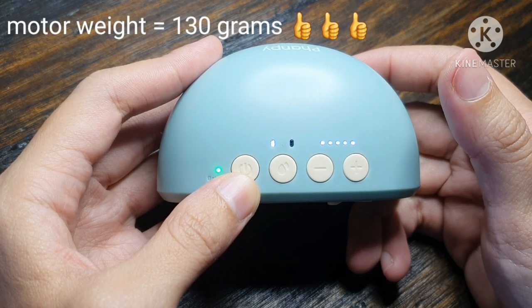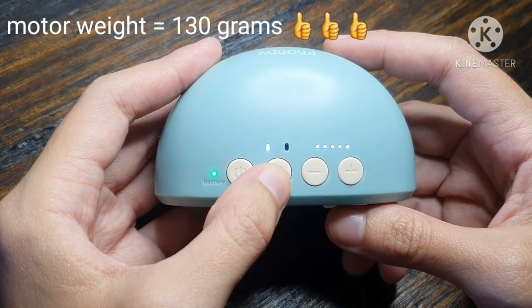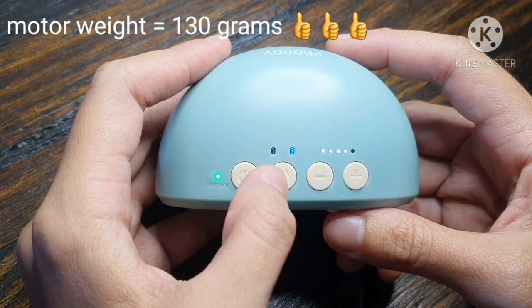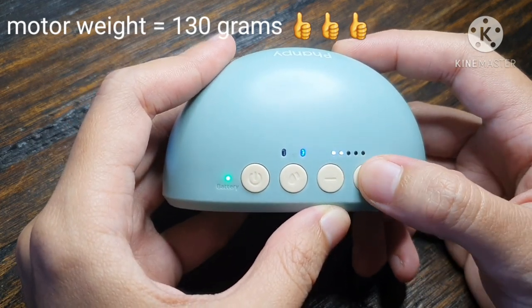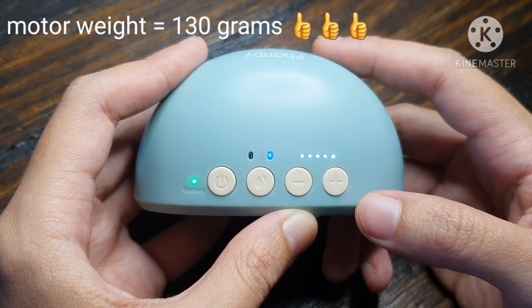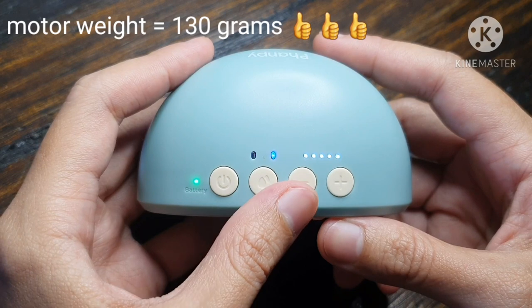Kapag naging busy kayong mga mommies, automatically from stimulation, after 20 minutes, magiging expression mode na siya. So press na natin yung button para ma-shift na siya to expression mode. Color blue siya kapag expression mode na siya. Naka-level 4 na siya. Ito yung level 1, level 2, level 3, level 4, level 5. Malakas talaga siya kapag yung suction. Hindi siya kasing quiet ng The Inns Gen 2, pero tolerable naman yung noise niya.